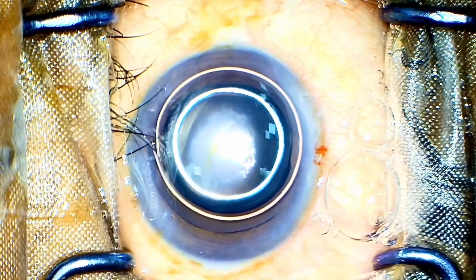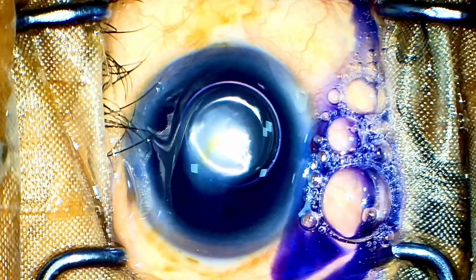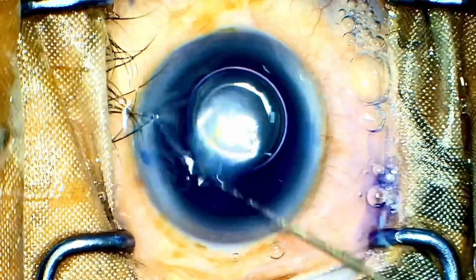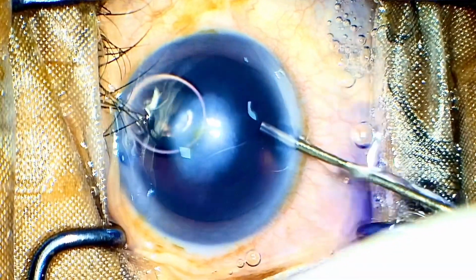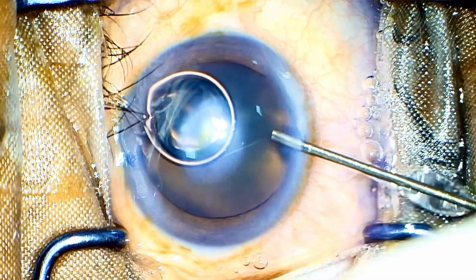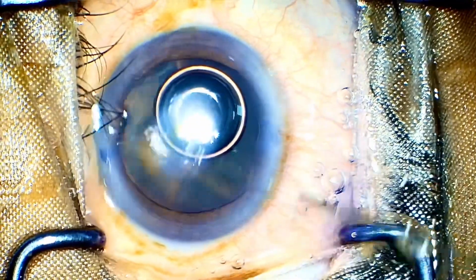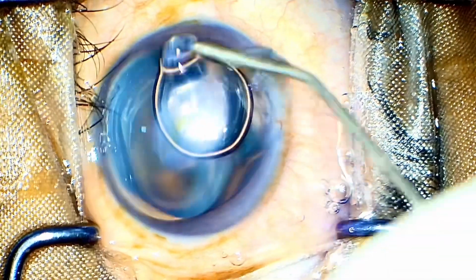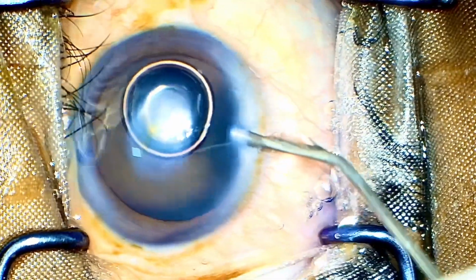More and more of these young patients present to you in the OPD with the same request of removing their glasses. The common reason I get is financial constraints these days, especially in the developing countries where myopia is increasing at a very fast pace. This man requested me and I took up this case. We did not have any option to decrease his myopia, but I thought that I'll go with a refractive lens exchange in this patient with a central corneal opacity.